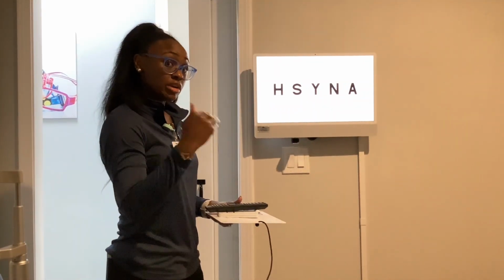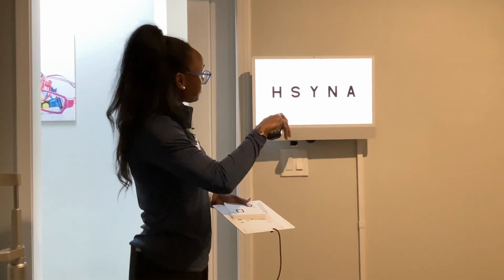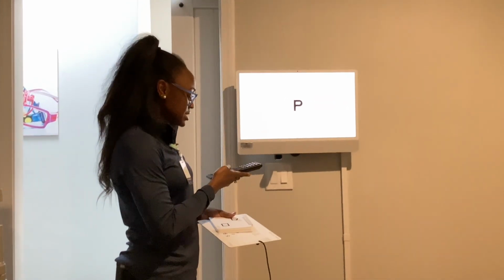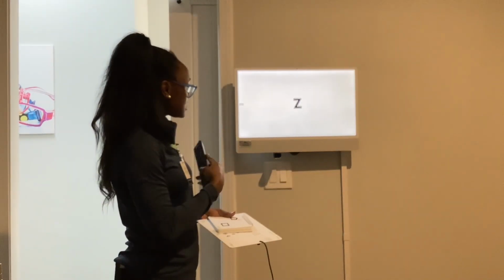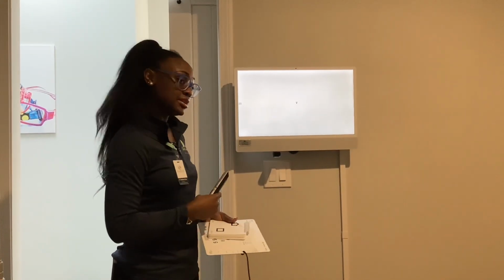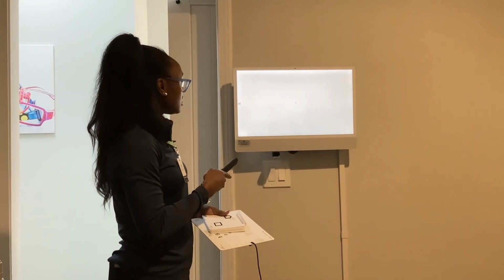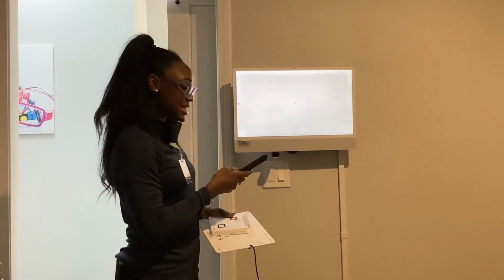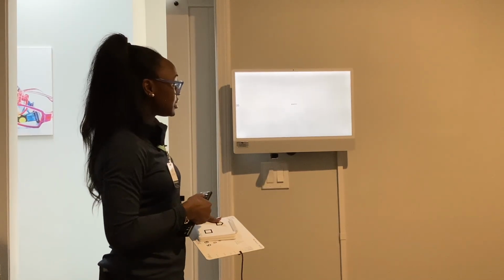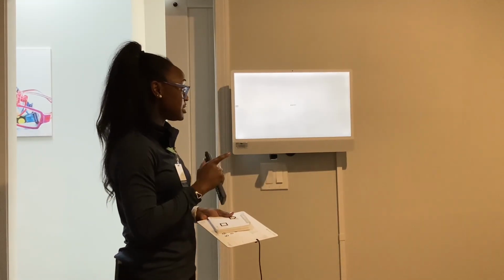Again, if they're kindergarten up, which is typically going to be 5 years of age, we can isolate. There, we have one letter. If they're able to see that pretty easily, a lot of times I'll go down to the next one, Z. Then I'll skip to about 20/50 or 20/60. If they're still seeing it, we'll go here all the way down to 20/20. Once they see that letter Z on the screen, I will show the remainder of the 5 letters and have them tell me exactly what letters they are. E, B, F, P, Y.